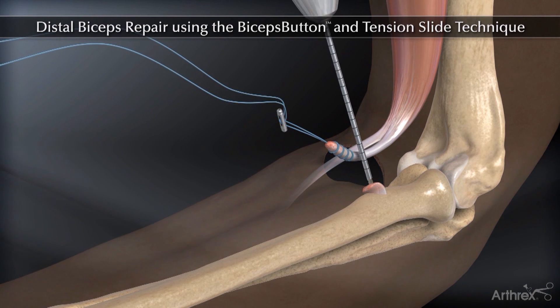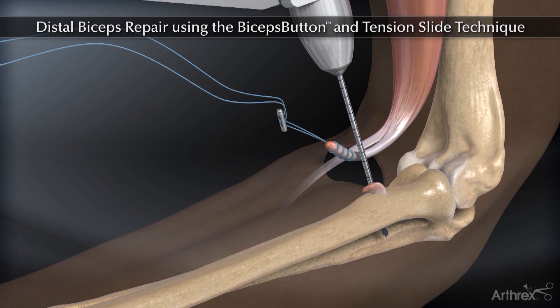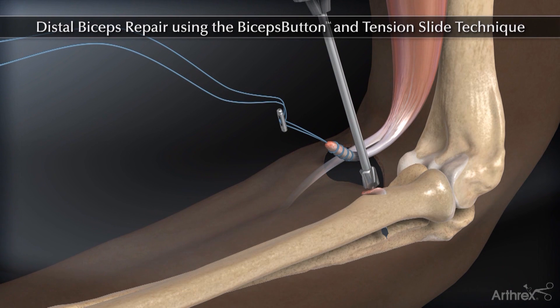Drill a bicortical tunnel in the radial tuberosity, then drill a unicortical tunnel over the guide pin.